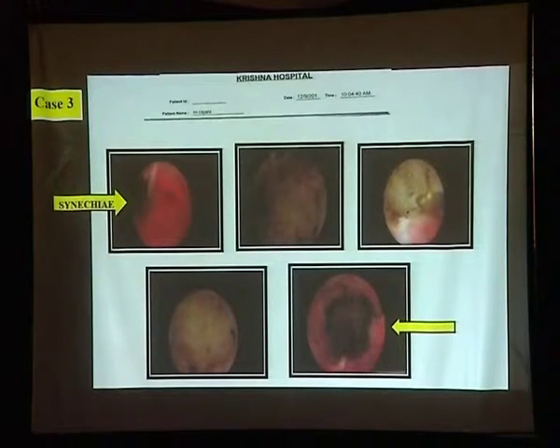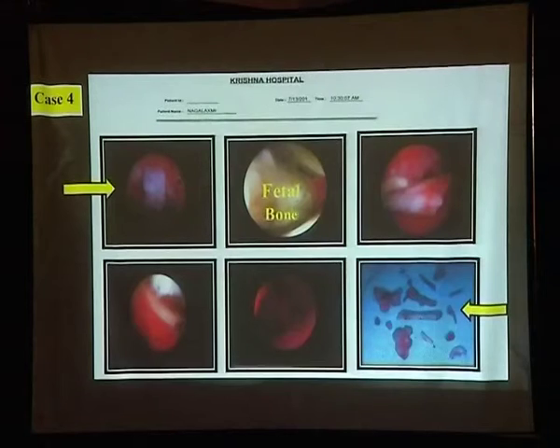This patient is a case of intrauterine Asherman syndrome. The patient came with amenorrhea, she is ovulating. Hysteroscopy shows multiple defects. I posted her for hysteroscopy and did adhesiolysis of the cavity. Afterwards, I kept a copper T and gave estrogen for 3 cycles. The patient is menstruating, not yet conceived. History of menstruating cycles since 2 years.